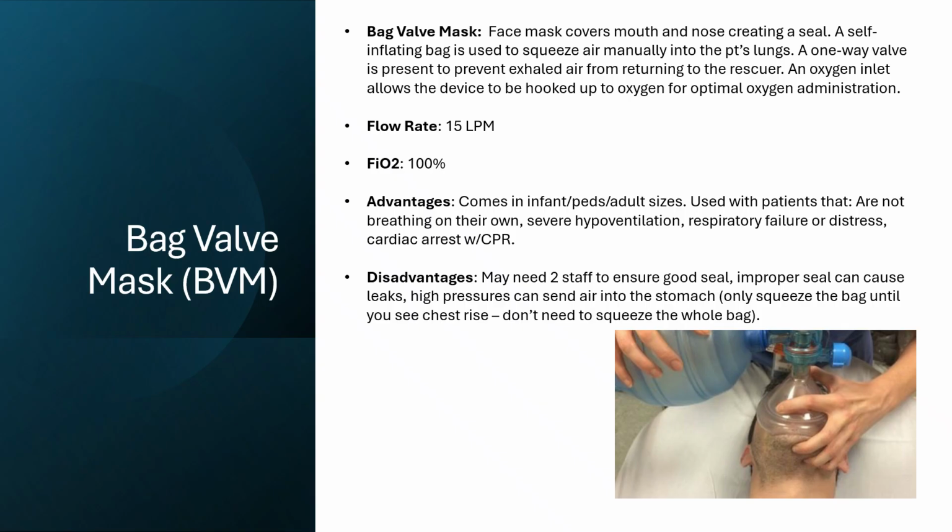It comes in infant, peds, and adult sizes, and it's used with patients who are not breathing on their own, so they're apneic. They've got severe hypoventilation, respiratory failure or distress, or you have a patient that's in cardiac arrest and you're doing some CPR. Severe hypoventilation, that could also be maybe you've sedated somebody, you know, or they come in altered and you don't know why yet. This might be a good option.